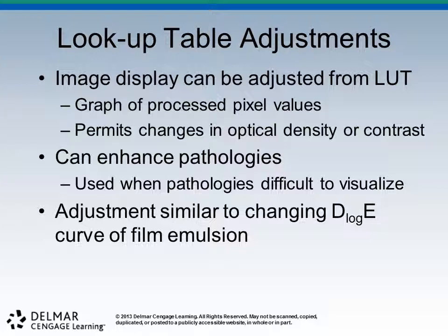I go back and forth when it comes to quality between film and CR/DR. There are some limitations as far as spatial limitations. Film crystals can be made smaller so they can have enhanced detail because of that. But in the past couple of years, we've discovered that we can make display pixels in the output monitors almost as small, if not as small, as the film crystal. So now we're approaching where film and CR have the same ability to form detail. Whether or not we can display that detail, well, gosh, we're getting awful close with that too.